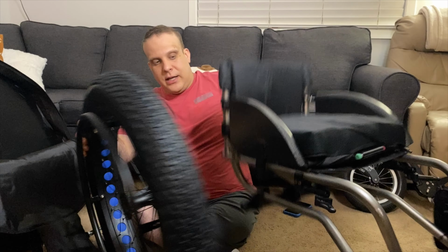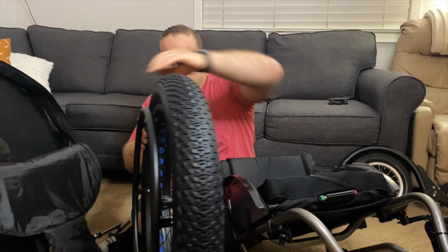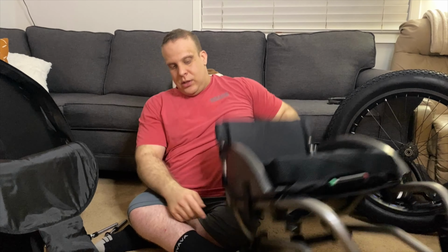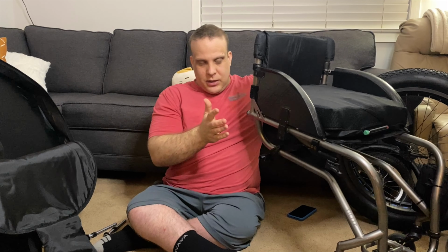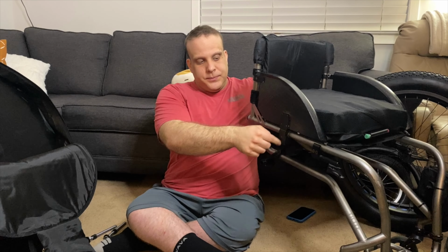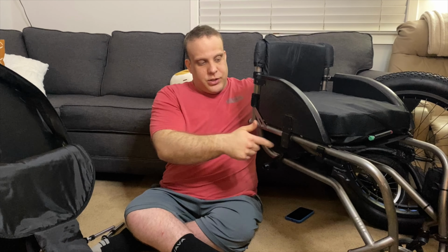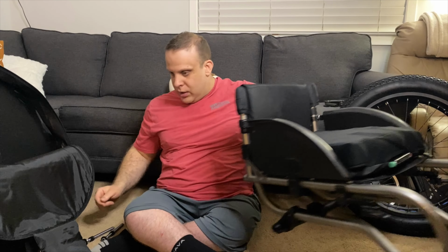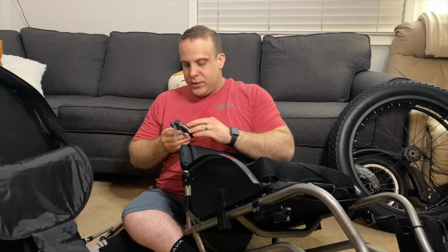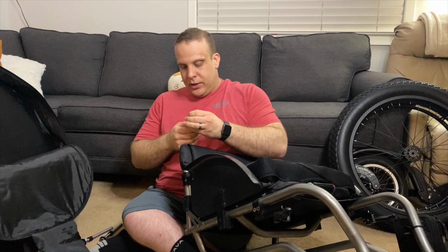So what I realized after I set these up a little bit is what I can do is, there's two. This is my Tie Light, so this is going to vary widely depending on your chair, but these are not welded onto the chair. They're adjustable and they're removable. So what I can do is I can take my Allen wrench and loosen the little bolts here.